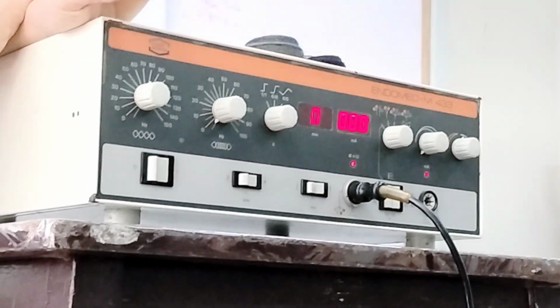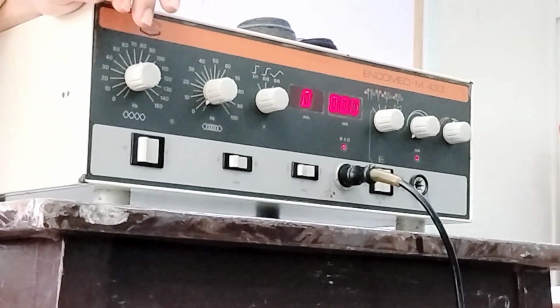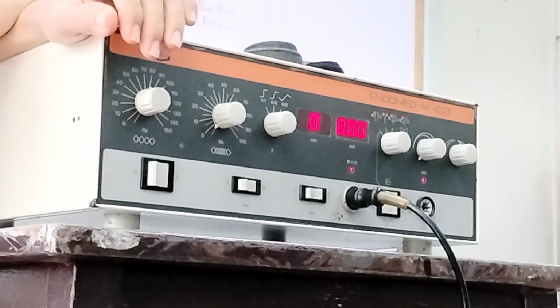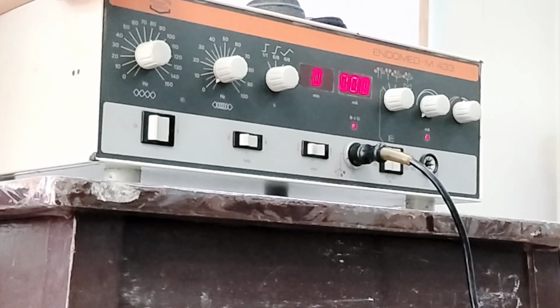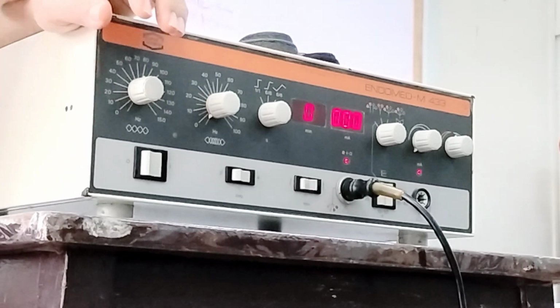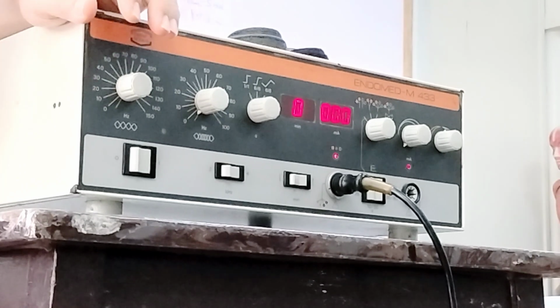is it in front? Is it at the back? Or is it at the side? The patient just says the entire shoulder. So therefore, they cannot localize. So you can now apply your vector scan, so the entire shoulder would now be scanned with this current. Okay?